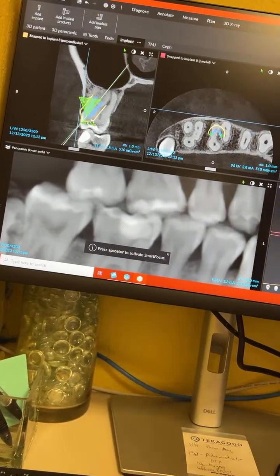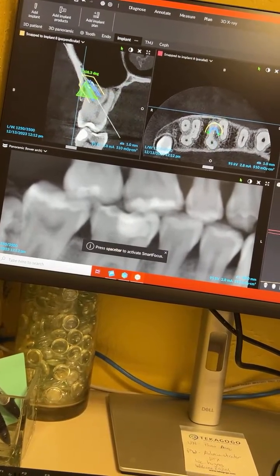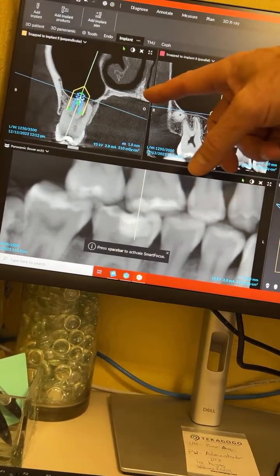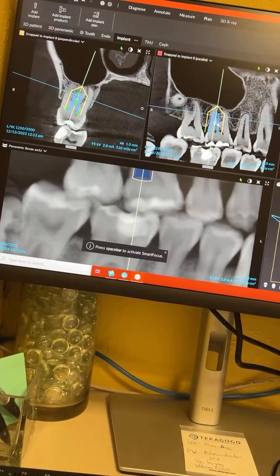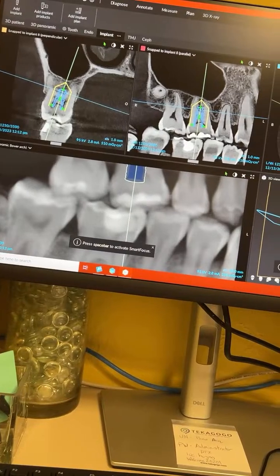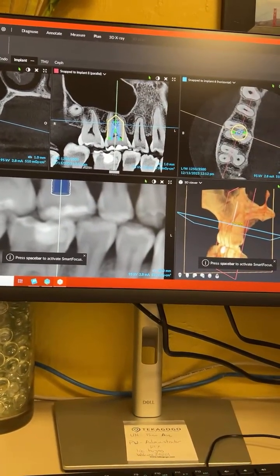Rotate it. There you go. You probably go the other way. There you go. Oh, you had it. But you look there, okay, how you can see it. Now you can take the plus, yep, and drag it. There you go. You can't make a mistake. All right. Looks good. And then select.